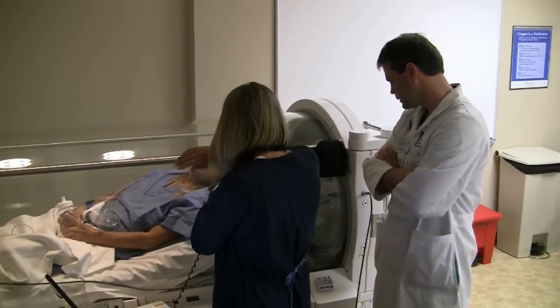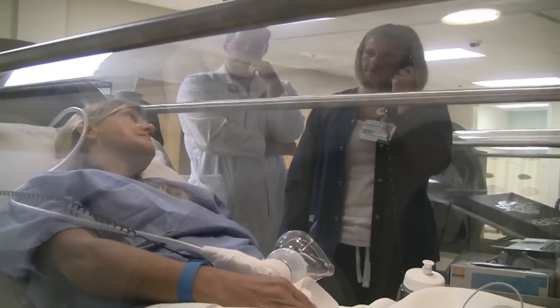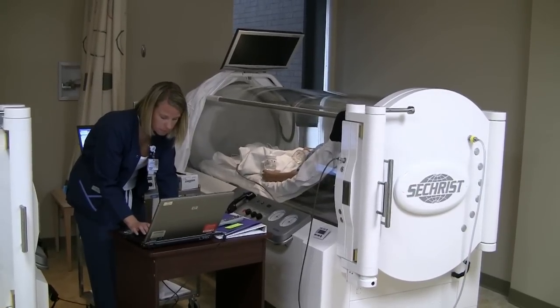Here we have a physician-based clinic — we have a physician here 40 hours a week. Having the expert nurses on staff, the expert HBO technicians, and our panel of physicians allows us to treat the entire patient. For the right patient in the right situation, hyperbaric oxygen is a wonderful tool and has a lot of very good research behind it that shows that it works.